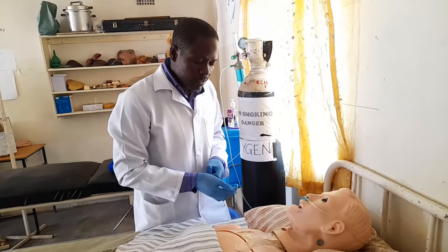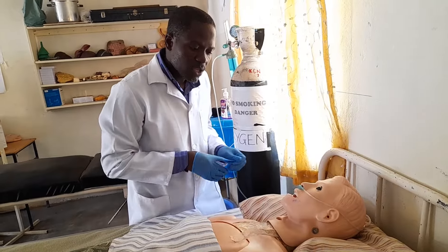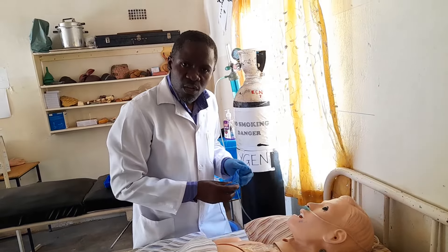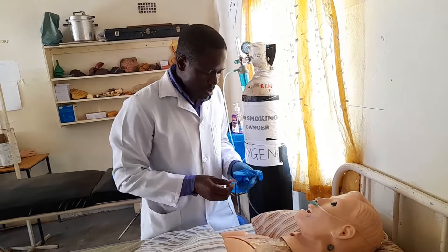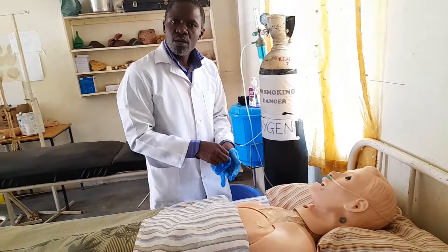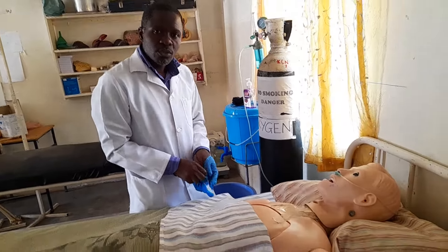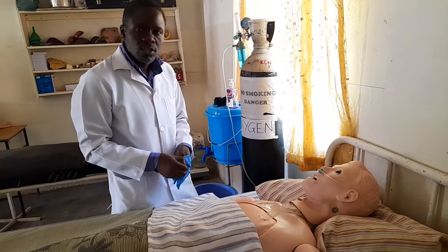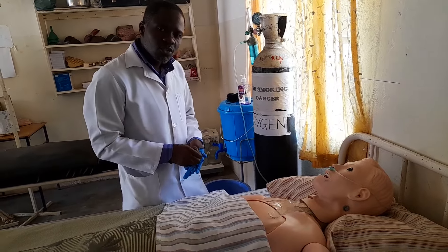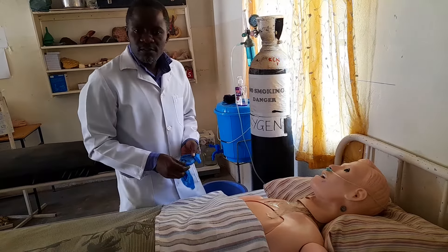After you finish, thank the patient: 'Thank you Mr. Mulenga for allowing me to do this procedure. I'm doing this procedure so that we administer oxygen to you, thank you very much.' Then go and report to the ward in charge that you've administered oxygen to Mr. Mulenga and left the patient comfortable.